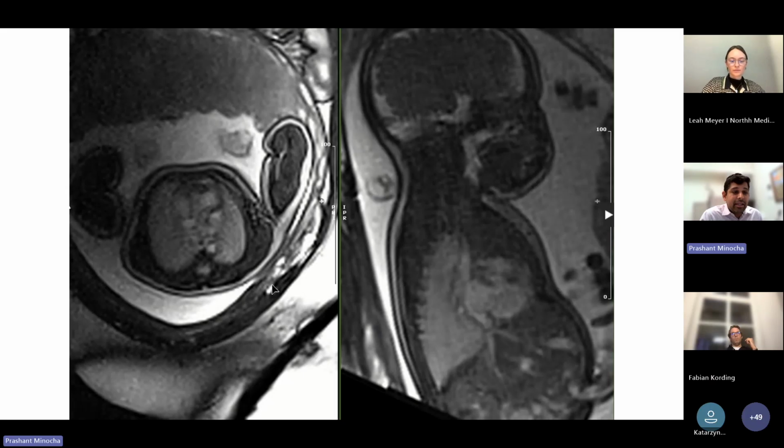So we went looking and scrutinizing the MRI images a little bit more. And we were able to determine that there was actually a left-sided IVC and a larger left-sided SVC. And as we let this play, the aortic arch is unobstructed. And as we go more rightward in this stack, you can see there's a right-sided SVC. So bilateral SVCs with a much larger left-sided SVC.